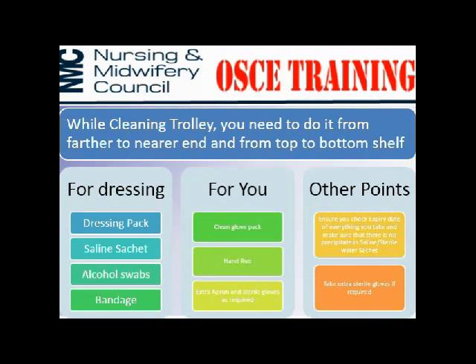The top shelf of the trolley you should consider as sterile. You should not touch the top part of the trolley when you are moving the trolley from your side to the patient side. This is very important. Now you are going to assemble the things for the ANTT procedure, and you need to keep all the things in the bottom of the trolley.